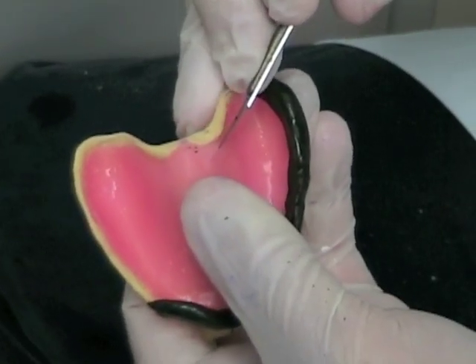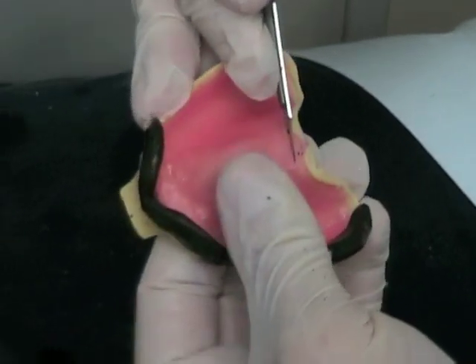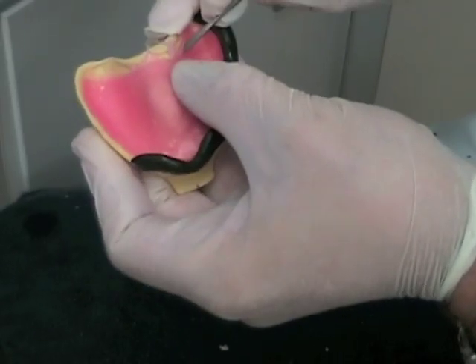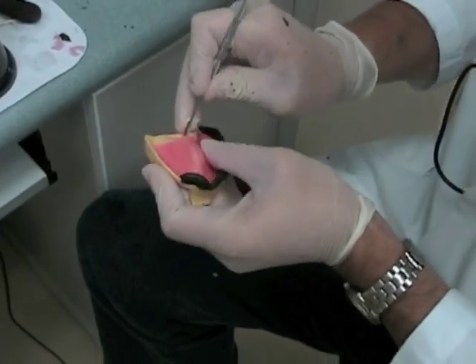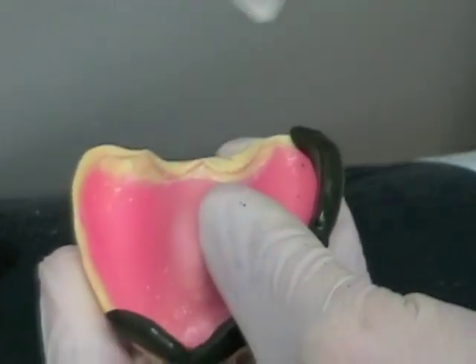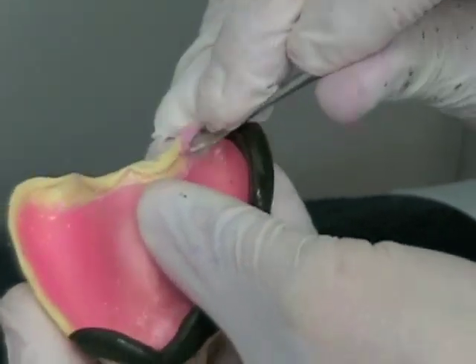At the posterior border of the tray, the compound is placed on top of the tray, not on its edge. You should have already trimmed the tray to the posterior palatal seal and you don't want to overextend it. If the wax spacer is too close to the posterior border, you may have to remove a little bit so that the compound is sitting on top of the tray and not on the wax. Otherwise, when you remove the wax spacer, it will crack the compound off of the tray.